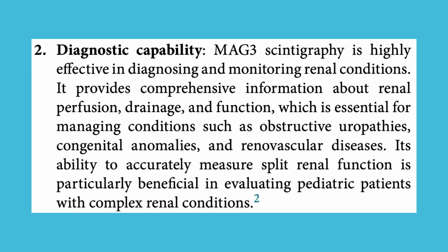2. Diagnostic capability. MAG3 scintigraphy is highly effective in diagnosing and monitoring renal conditions. It provides comprehensive information about renal perfusion, drainage, and function, which is essential for managing conditions such as obstructive uropathies, congenital anomalies, and renovascular diseases. Its ability to accurately measure split renal function is particularly beneficial in evaluating pediatric patients with complex renal conditions.